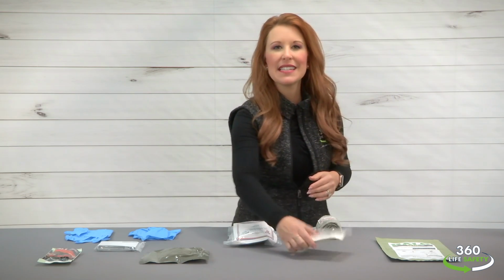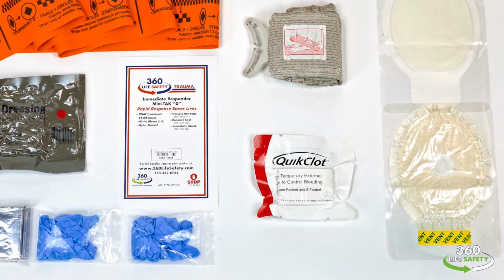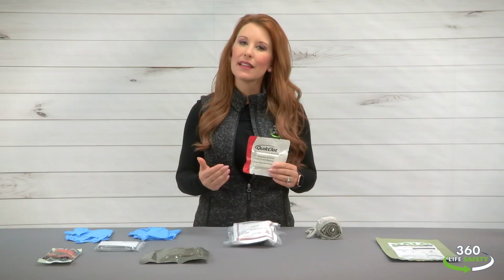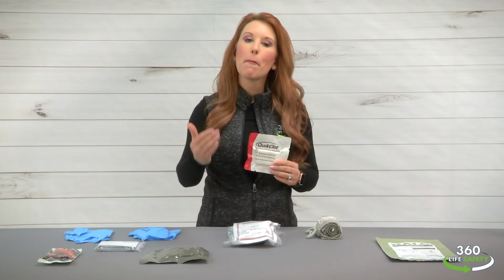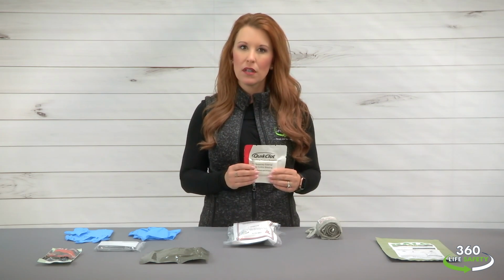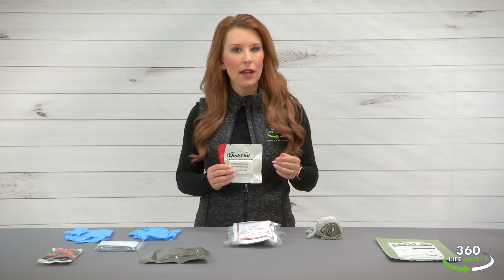And the product that the D kit adds that I think is so awesome is this hemostatic gauze. The one we utilize is Quick Clot. What makes hemostatic gauze so unique is that it's impregnated with an agent that promotes blood coagulation or clotting, assisting in hemorrhage control. So there may be an area with a deep laceration that you can't tourniquet, right?